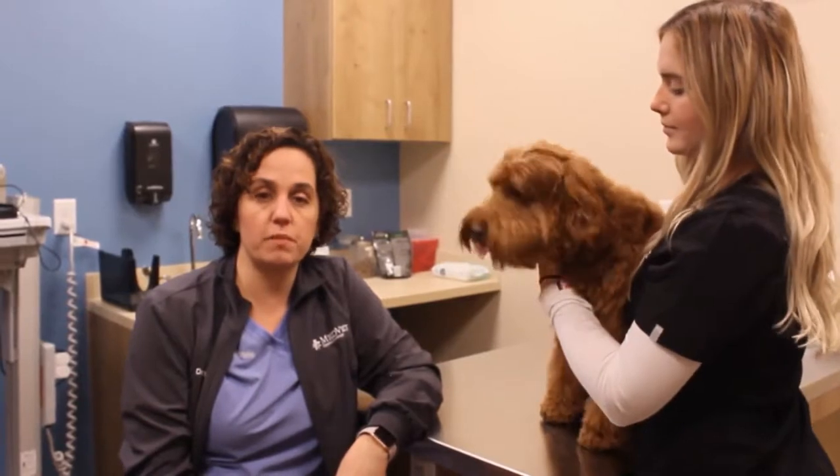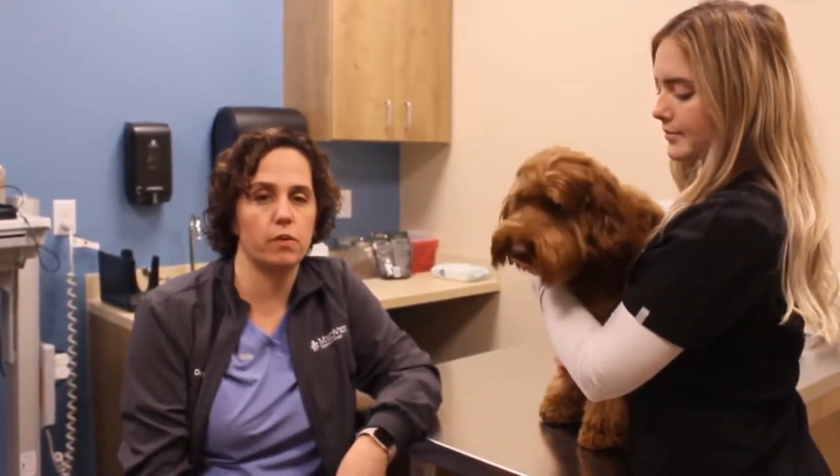After the exam is completed we go through the findings that we have, any diagnoses that we're making today. We talk about treatment options and how we can move forward to make your pet better.